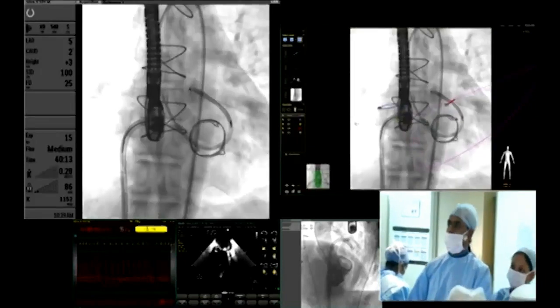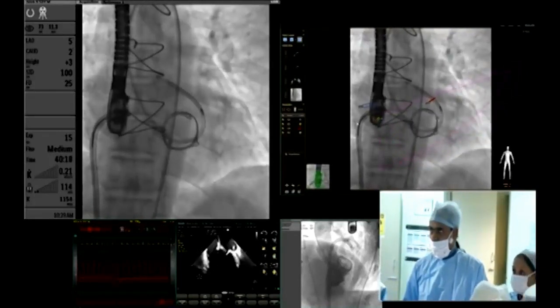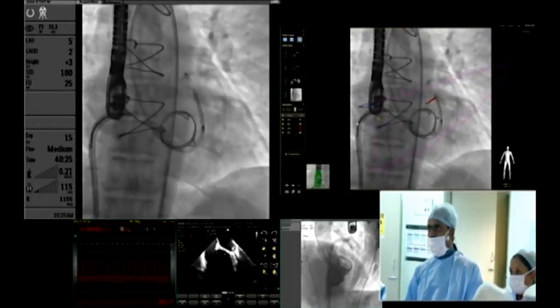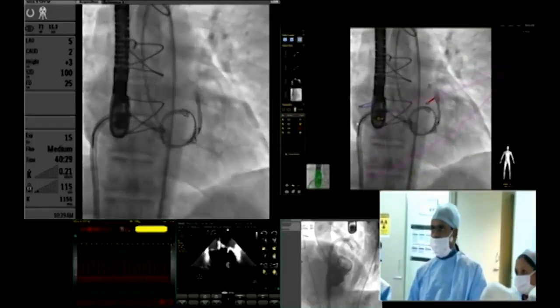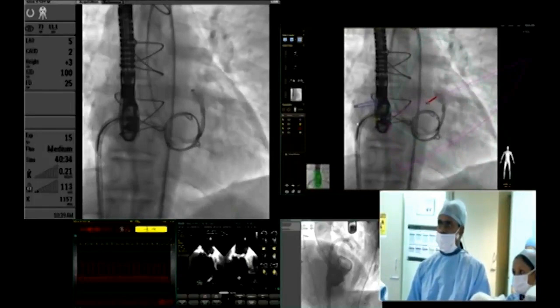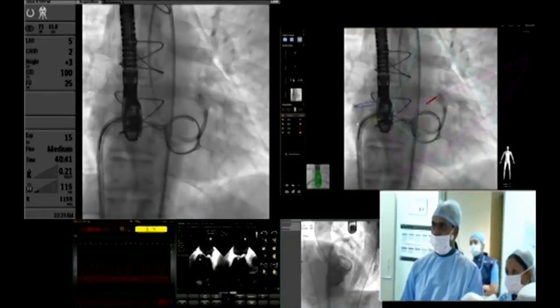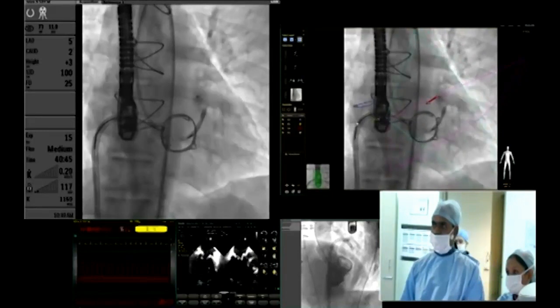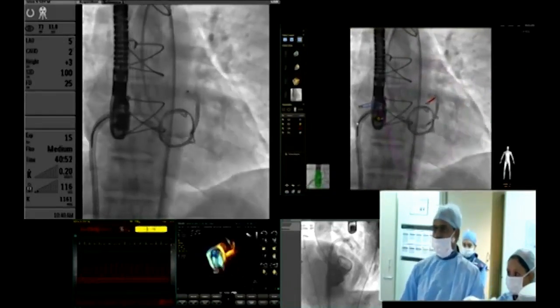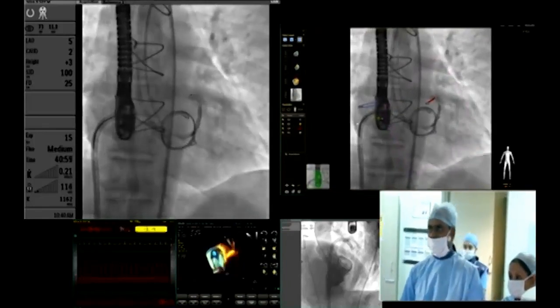The distal-most disc with two layers is opened into the LA. The second disc will be in the tract and the third will be in the ventricle. So now 3D echo starts. We have the echo — widen it out and get the 3D. Yeah, that is all — now we can see the device on that corner. Sreeja, crop some of the left atrium — there is too much of left atrium.